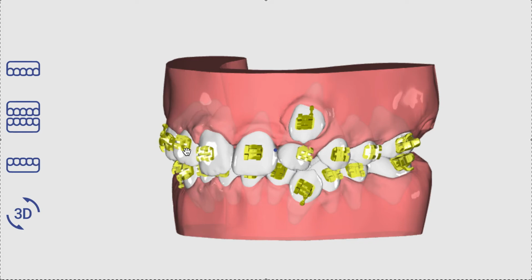This is the same technology and the same software that orthodontists use when they want to do IDB. Yes, a lot of orthodontists do IDB because it frees up their chair time. Otherwise the ortho has to sit there and place it in the chair. If they approve the bracket placement digitally, and there's an approval process that goes with this, then you've already approved the bracket placement. In most states, then the team can put the brackets on, cure everything like that, and the ortho will just check on the way out.